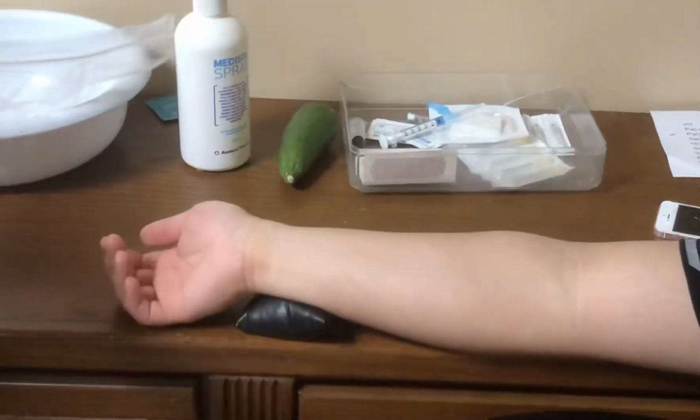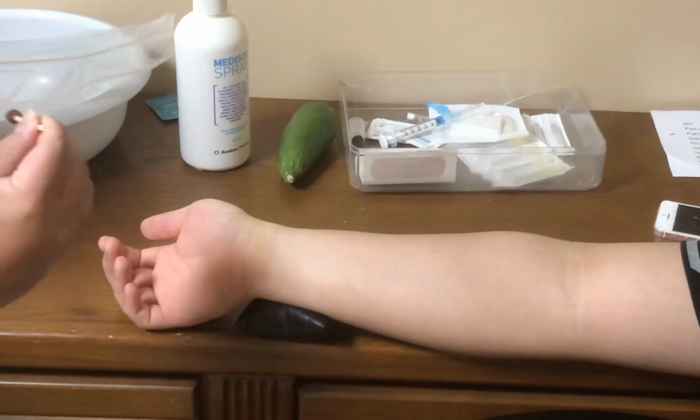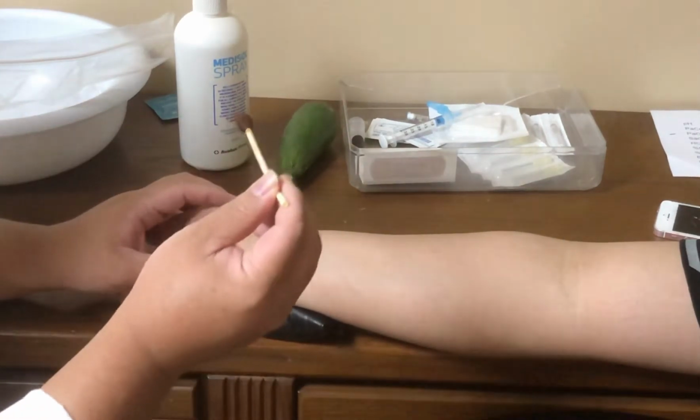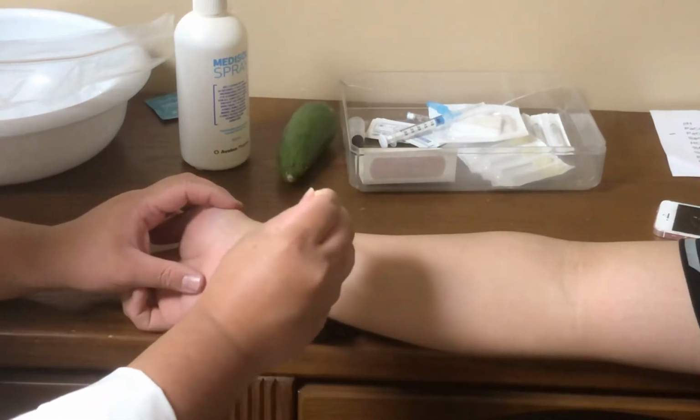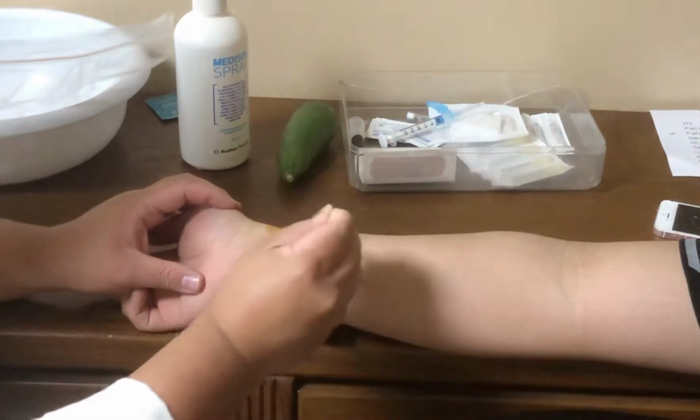So now, using the povidone-iodine prep swab, we're going to move in a circular motion outward. We're going to be spreading it over the radial artery of the patient and outwards.